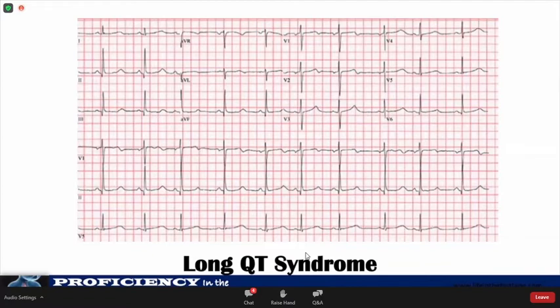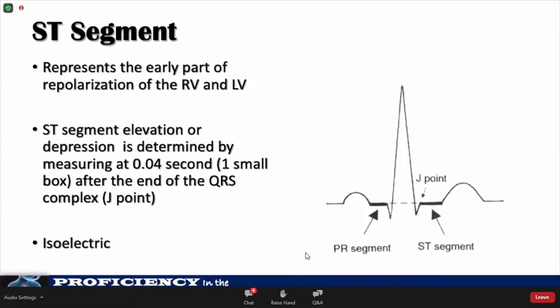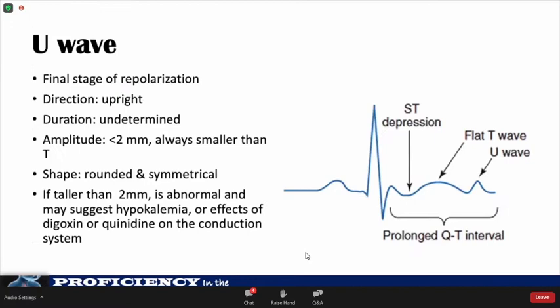Moving on to the ST segment: measured from the end of the QRS complex to the beginning of the T-wave, it represents the early part of repolarization. This is normally isoelectric — flat along the baseline. ST segment elevation or depression is determined by measuring 0.04 seconds (one small box) after the end of the QRS complex at the J-point. Changes in the ST segment can reflect either ischemia or inflammation, though ischemia is quite unusual in the pediatric population. Finally, the U-wave represents the final stage of repolarization, and if it is taller than 2 mm, it may suggest hypokalemia or digoxin toxicity.